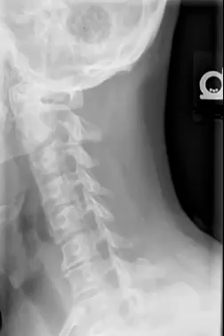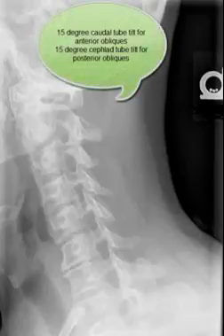And the way we do that is first by positioning the patient at a 45-degree angle to the bucky. This will allow for adequate visualization through the intervertebral foramen when combined with a tube tilt. Now, oblique projections can be taken in the A to P or P to A orientation. This will alter which direction your tube will be tilted, cephalad versus caudad, but anterior and posterior obliques will end up coming out, or developed, looking the same.